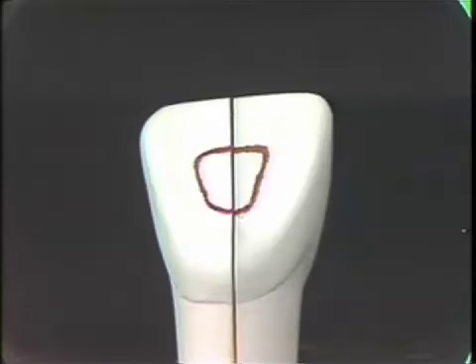In the clinic, the first thing that you would do before access preparation is to swab the tooth in the area with tincture of merthiolate. Here, working on the model, we'll skip that step. The second step is, once again, to visualize the pulp, its position, its shape. Really get a picture in your mind of where you're going with the tooth, and don't start until you're pretty sure you have it.